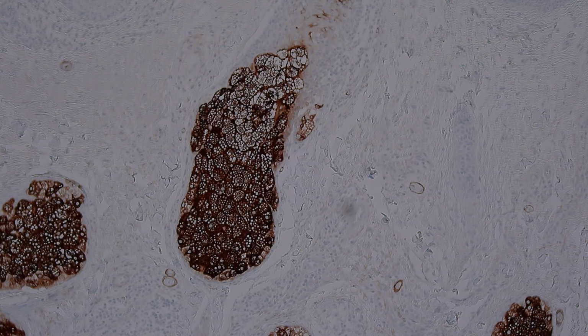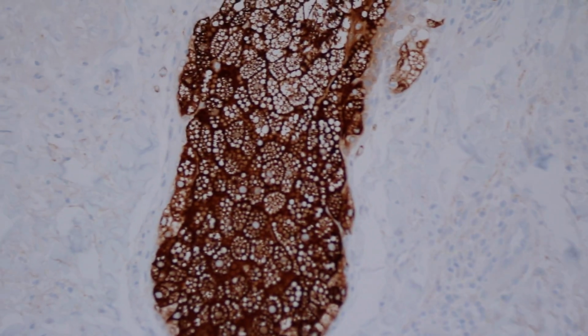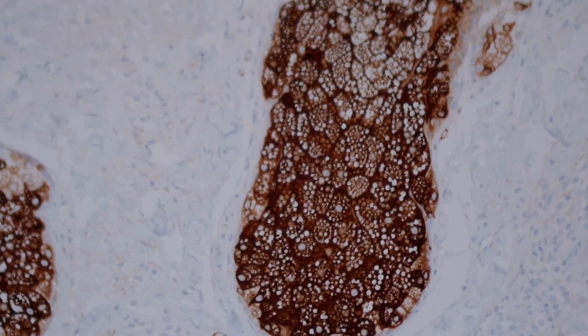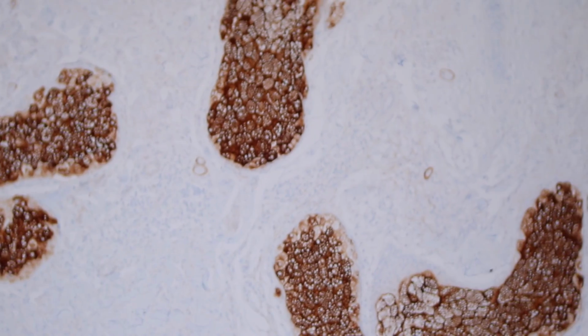I'm just kidding. Okay, so here are the sebaceous glands beautifully stained with EMA. And you can see that the EMA not only strongly stains them, but it really stains their cytoplasm in a way that makes the vacuoles, the bubbly lipid vacuoles, stand out. Like it highlights the membranes around each individual vacuole. It's really just a gorgeous stain. One of my favorites, really, in looking at sebaceous glands. Very pretty.